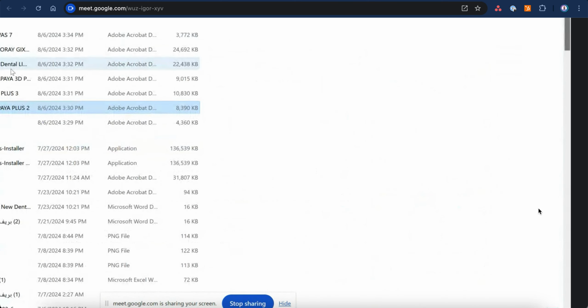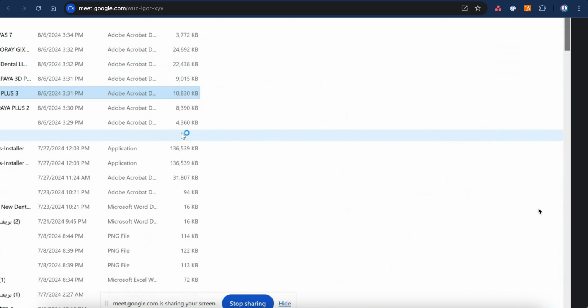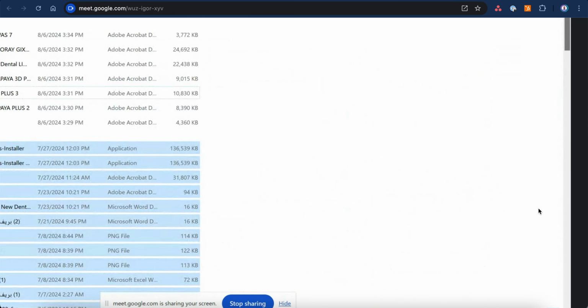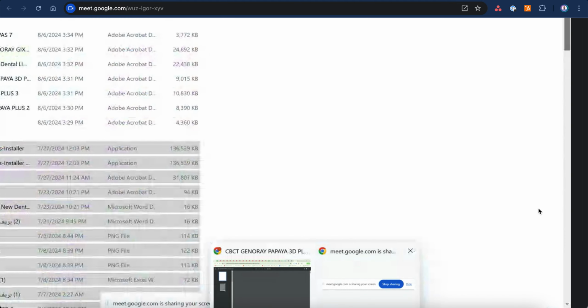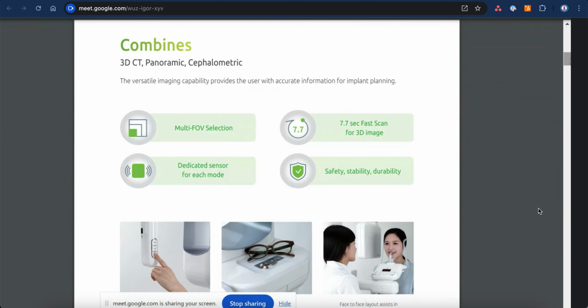I will go to the next. Okay, this is the 3D plus. This is 3D, so I'll have CBCT here. I can get the 3D image of the CBCT here. What do we have here? The 3D CT, which is the CBCT we call it in the industry. This is the panorama and the cephalo. Panorama cephalo, we have gone through it before. What is new here is the 3D CT.